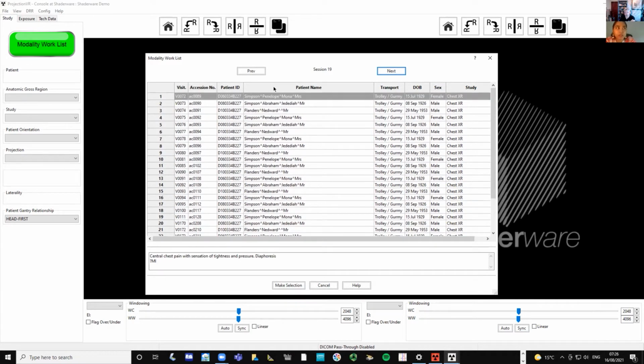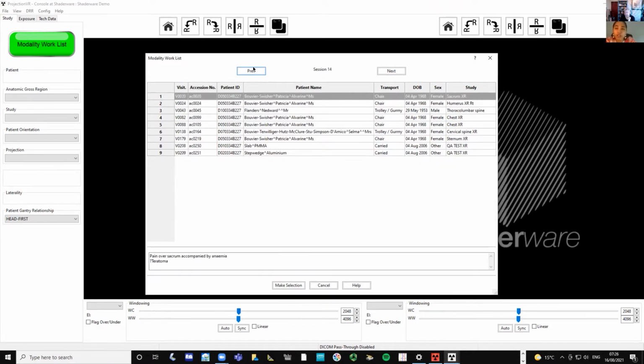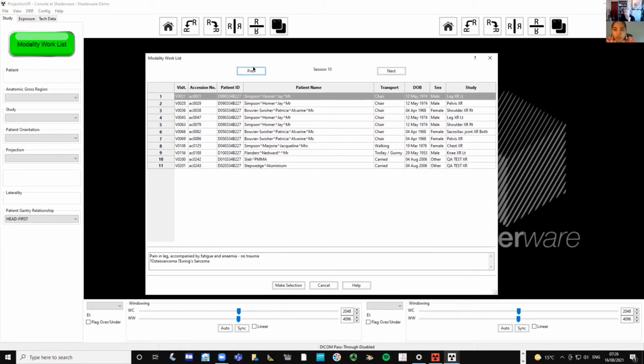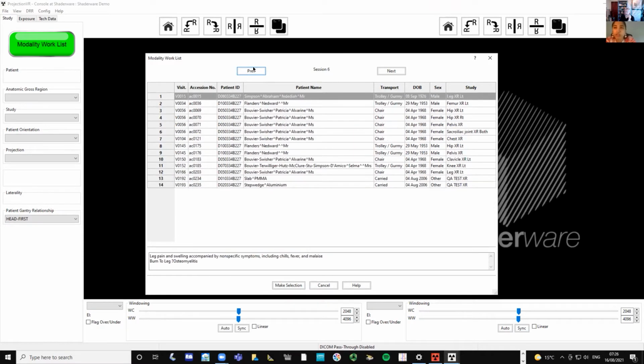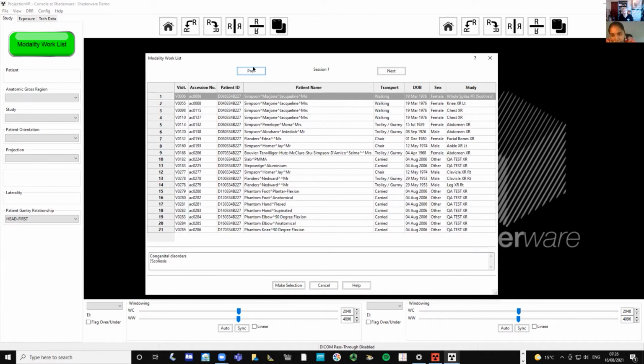So it depends. You have a technical support team that would supervise, just in case we wanted to add additional sessions with additional patients. Yeah, you could certainly send the list to us.